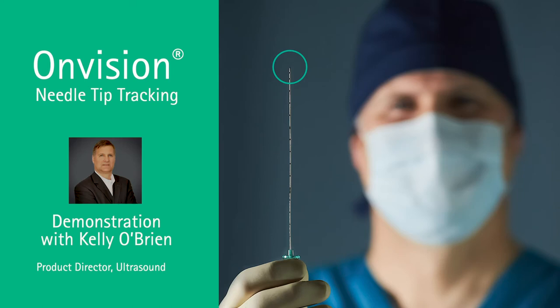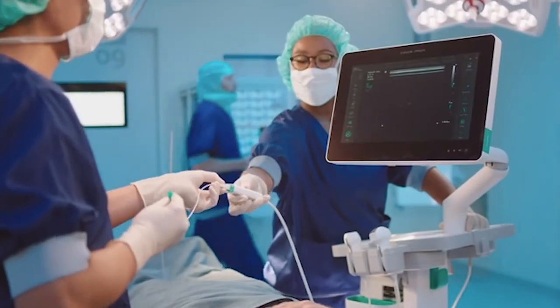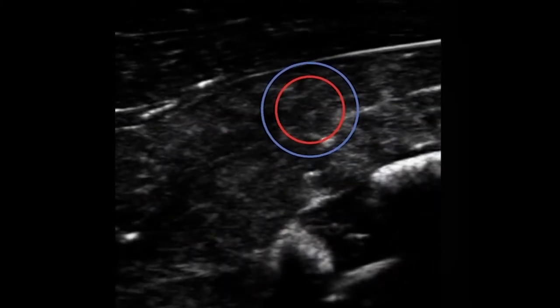I'm here today to demonstrate the Xperia ultrasound system with the revolutionary new OnVision Needle Tip Tracking technology.